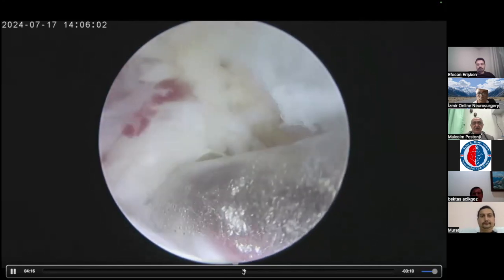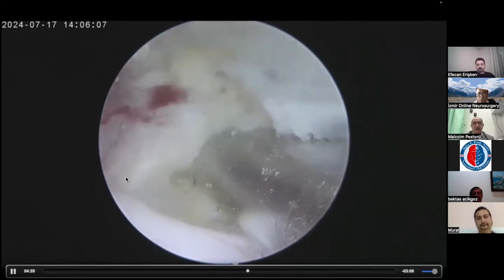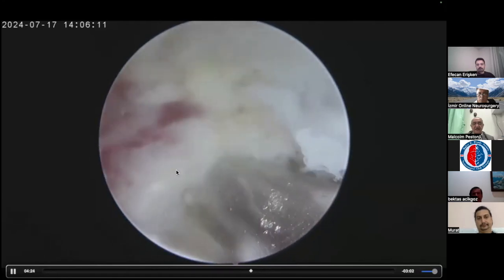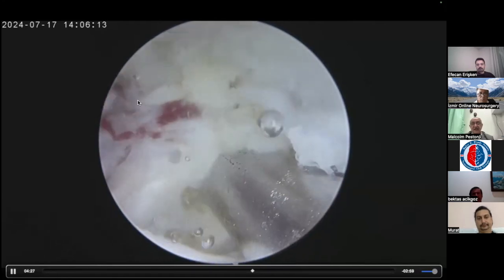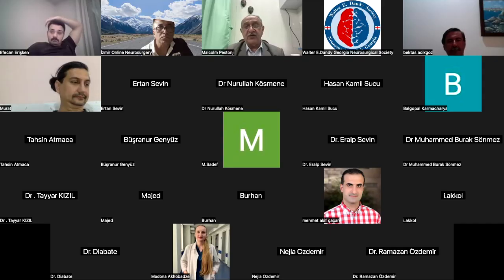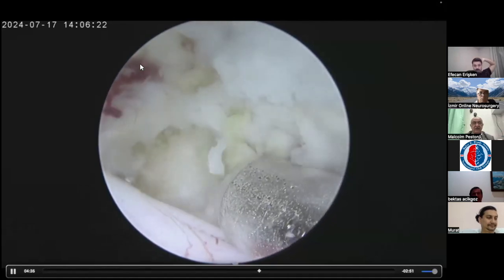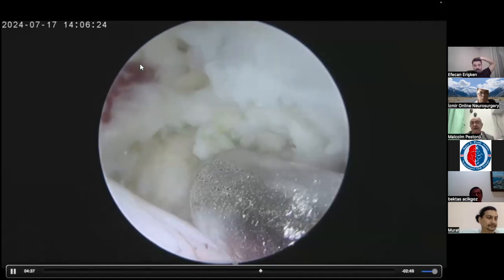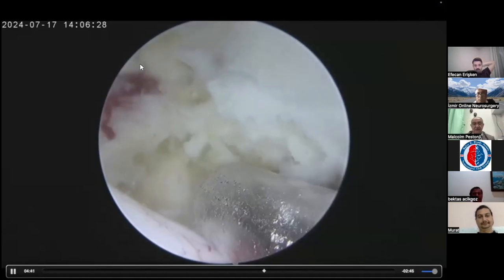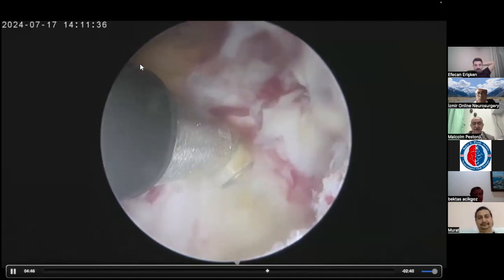And as I burn it away, you can see the calcified edge. Can you see this calcified edge coming in your view? That was the claw from the disc, discal surface claw. The root is still above. This is the vein. When we spoke of Para-UBE, I told you that the root will be proximal by 2-3 millimeters to the vein. So I'm quite safe. I'm burning away the nuclear material which is coming up, retaining as much of annular fibers as possible.